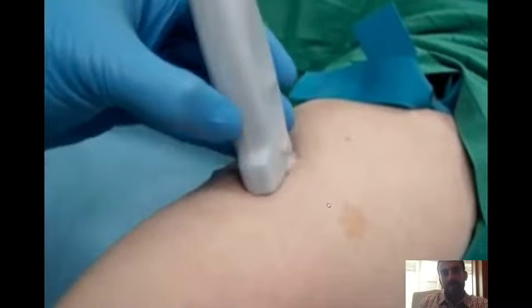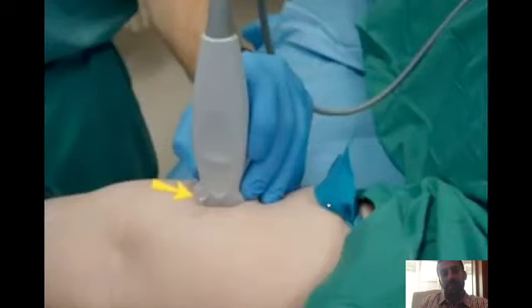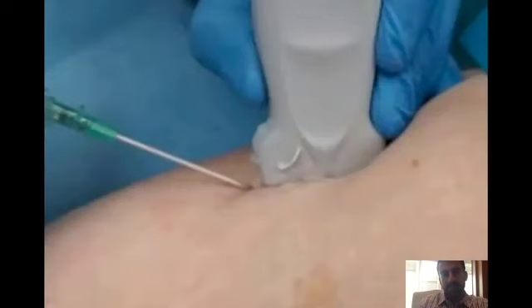So again, approaching that, the longitudinal approach shown here, you're just placing it such that the vein is over the ultrasound plane and visualizing that as it goes through is the next step.